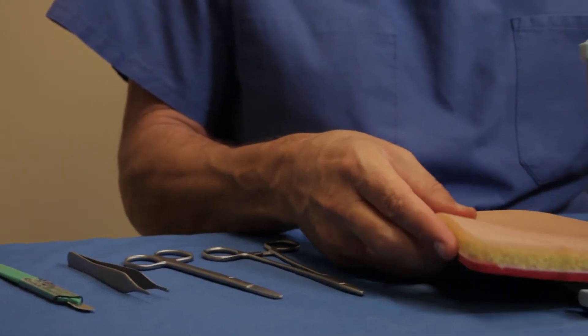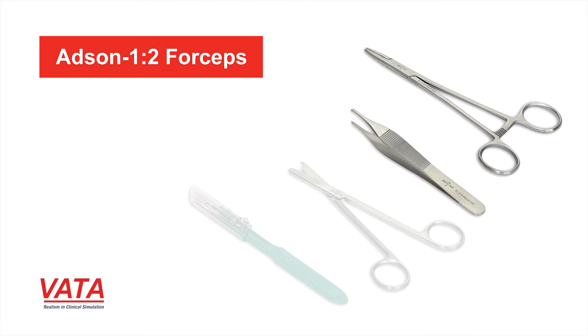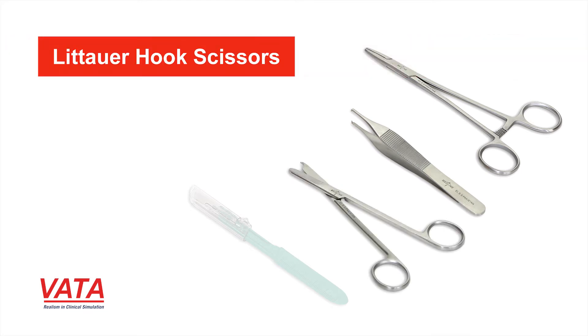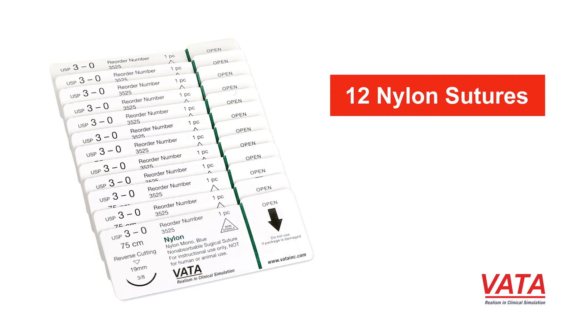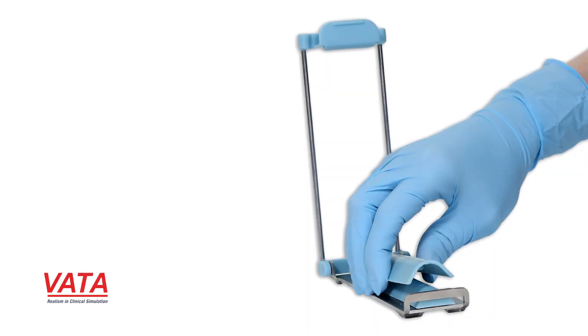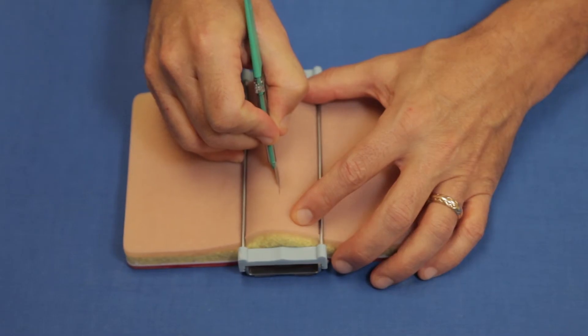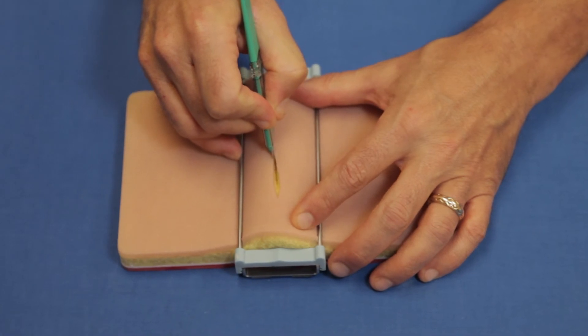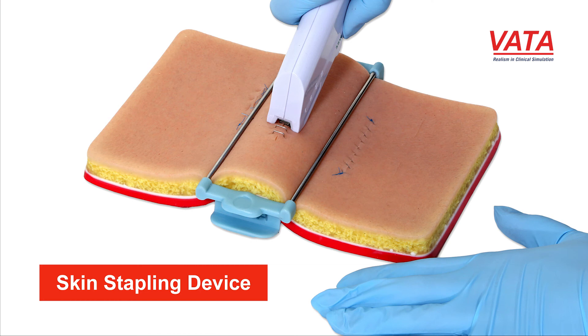The kit also comes with instruments you'll need for suturing. These are all high quality instruments including a needle driver, an Adson forceps which is single tooth, a suture scissor that has a small hook to make cutting sutures easier, and a number 10 blade with a protected tip. You also get 12 nylon sutures and a unique tensioning device — superior to anything else I've seen. By applying the tensioning device to the pad you get a natural gape in the wound, which you see in clinical scenarios, along with a stapling device for practice.